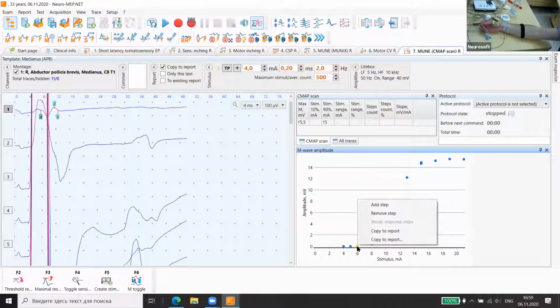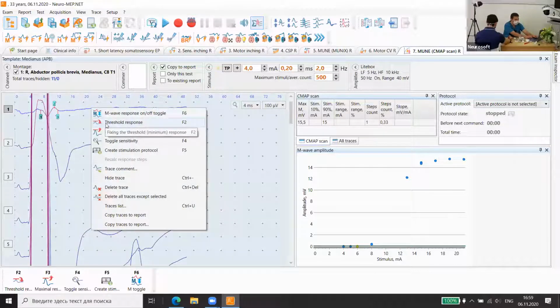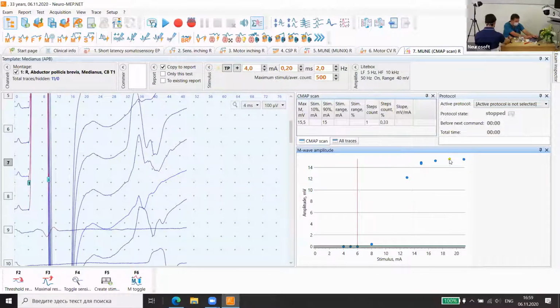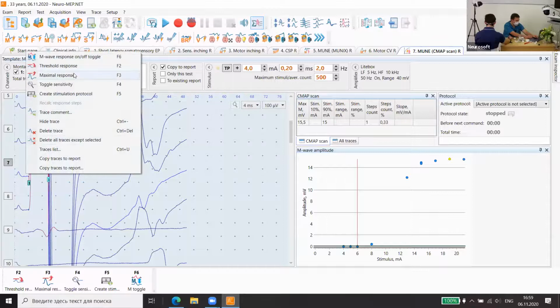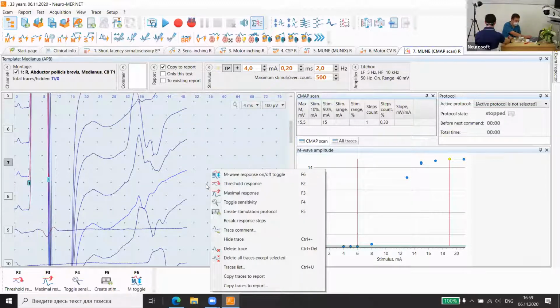It's at the curve. We can see its first line. It's a threshold response. We set it as a threshold response, and also we can see that is a supramaximal response. We set it as a maximal response, maximal supramaximal stimulation. So on these two parameters, the program can let us create a stimulation protocol.